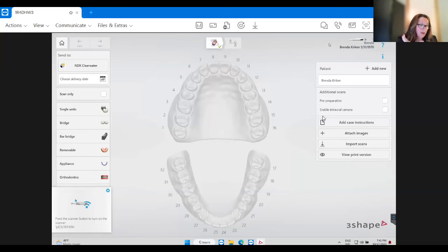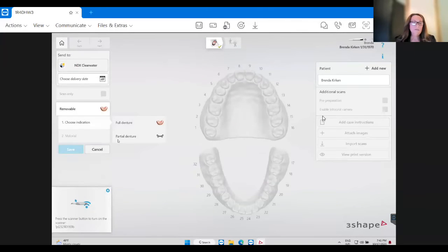That, or you have those patients that have such a wide arch and it's all acrylic. I mean, it's very flat. So we're going to go to removable. And so if a patient has an existing denture, that is the best custom tray that you'll ever get in your life for that patient.